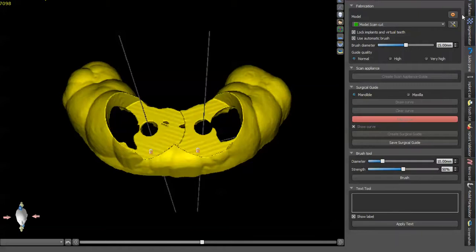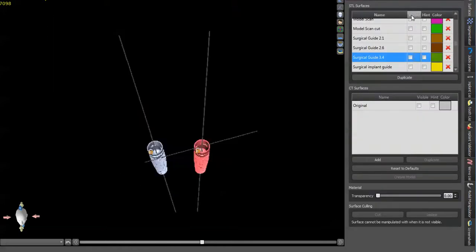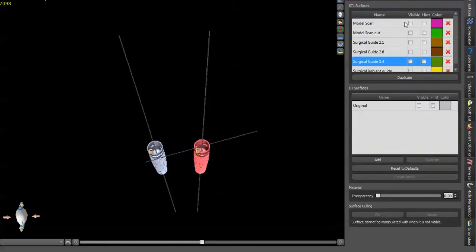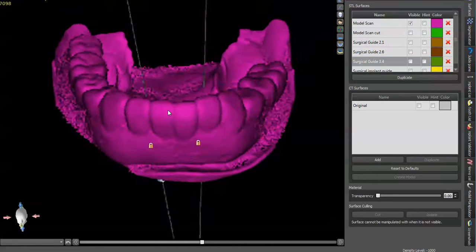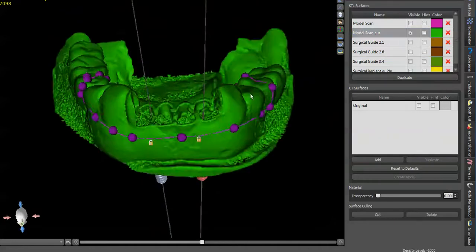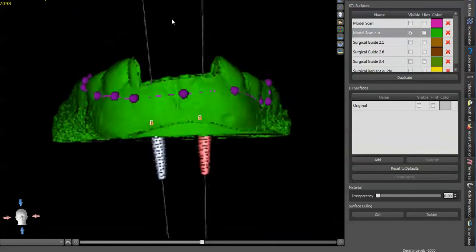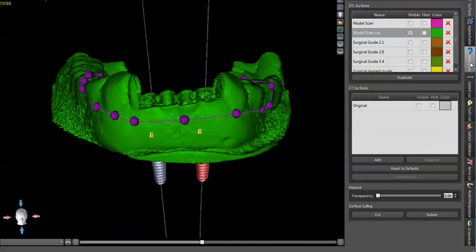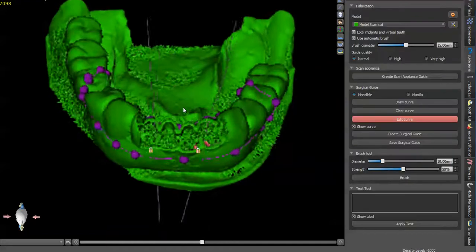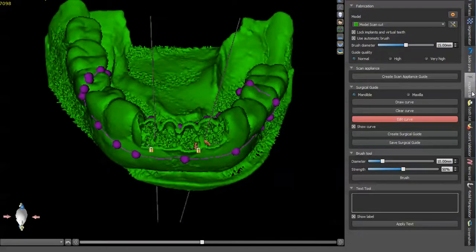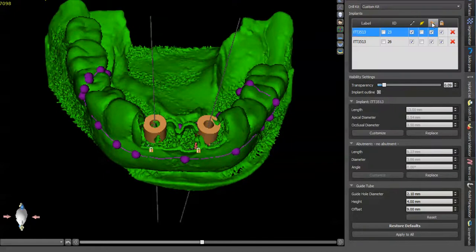So if you still want to make a pilot drill guide and you want to use the tubes, you have your model scan and then you cut those teeth off. And you go into guide panel and you're ready to make a guide.